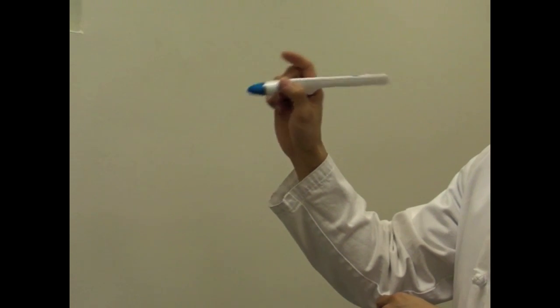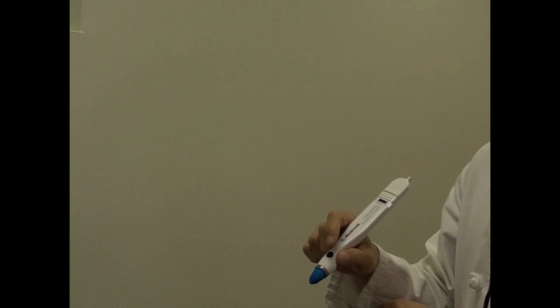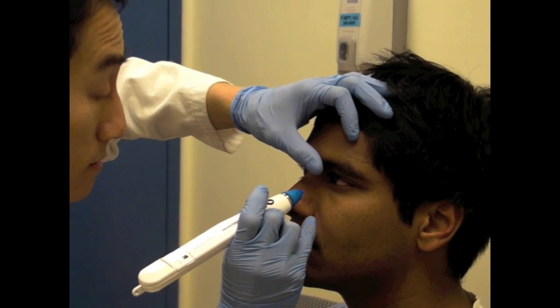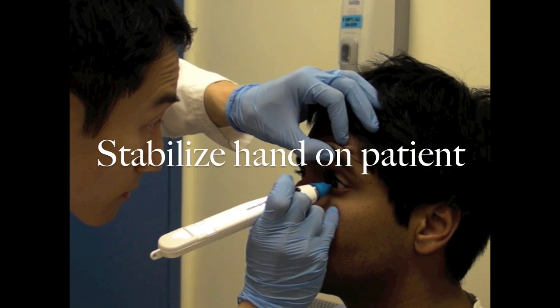Instead, you will want to use your wrist to take measurements, using a gentle flicking motion. Have the patient visually focus on a stationary target like your ear. Without pressing on the eyeball, gently lift up the upper eyelid. Brace your fifth finger or heel of your hand on the patient's cheek for stability.